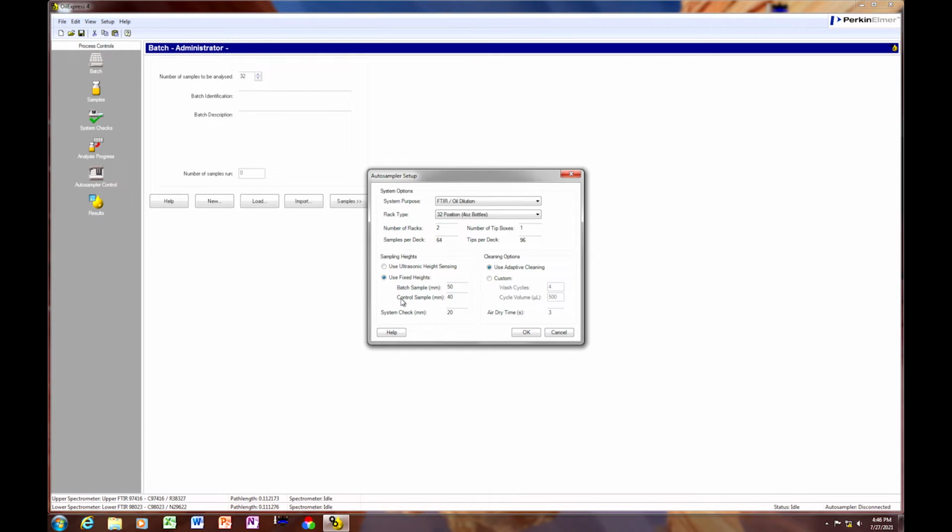There are two different heights there, one for control samples. Typically those will have less volume or smaller amounts, so you can set that to one number, and you can set your batch numbers to a different number. That number is dependent upon the measurement from the deck to the sample height. So if you pour up your samples to 75 millimeters, you're probably going to set this to about 50 to make sure you get an adequate amount of sample. Always set your numbers here about 10 millimeters or more lower than the actual sample height that you're pouring up.